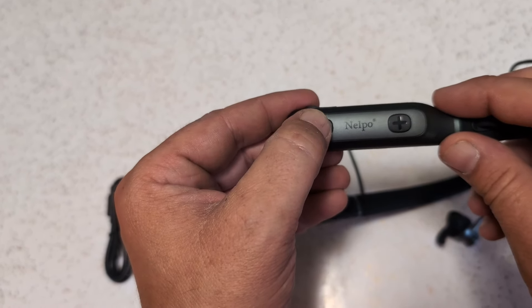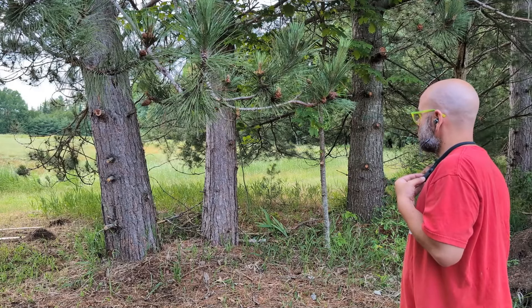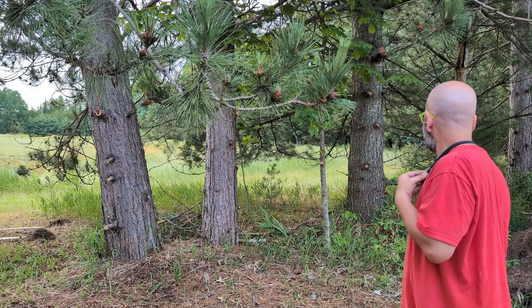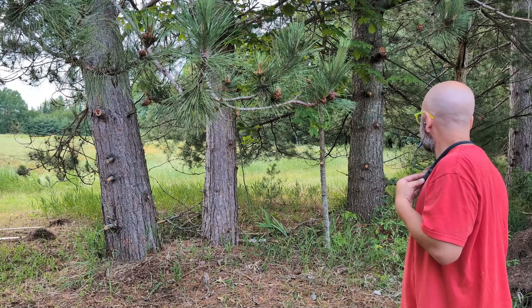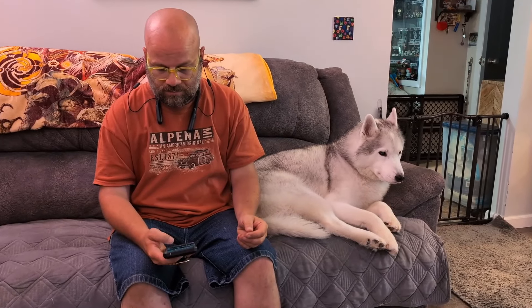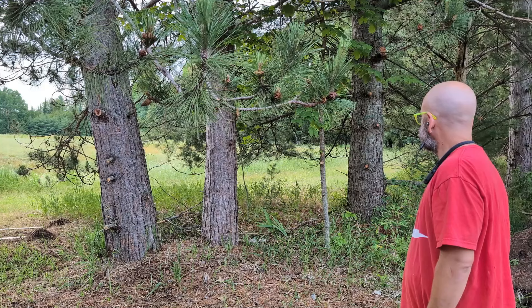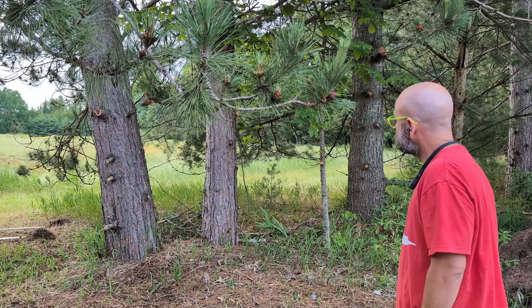It does have volume control, so depending on the situation you're in, you can turn it up or down to hear whatever's going on around you a little bit better. This also has six common preset hearing programs that you can use, and to change them, all you have to do is long press the volume button for about 2.5 seconds. Each of these modes amplifies the sound in a different way, so depending on the situation — whether you're outside or at a concert — you can change these and see what sounds best for you.